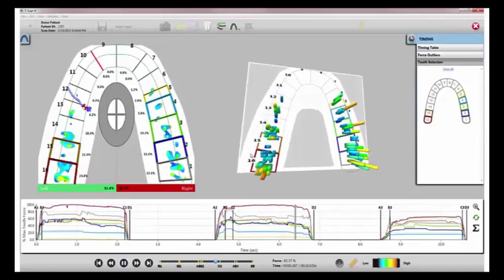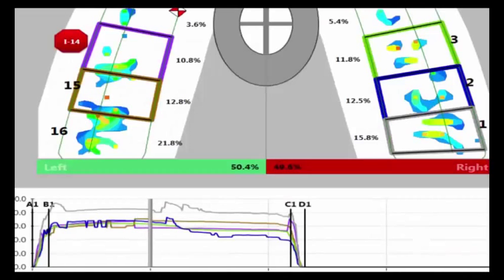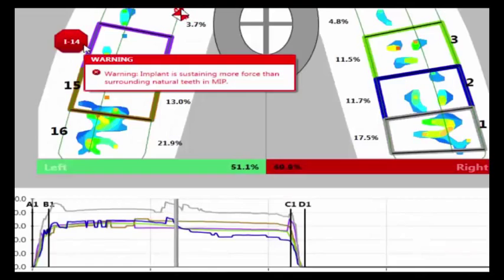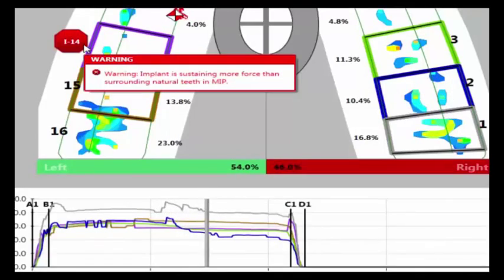To determine if an implant is the first point of contact, or to see if it's taking on more force than the surrounding natural teeth, you will be notified with an implant warning alert.